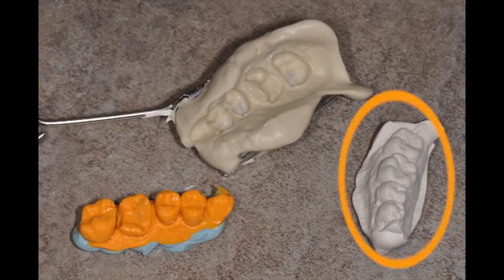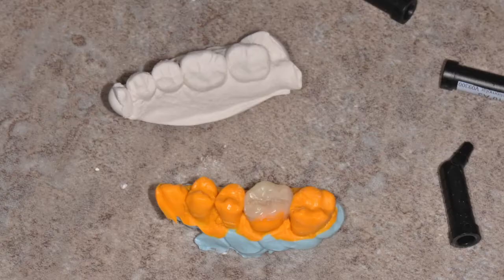The opposing side of the triple tray is poured with a quick-set stone and will be used to establish the occlusion for the composite onlay outside of the mouth. A microfill composite, which exhibits great wear properties and flexural strength, is incrementally placed on the silicone die and sculpted to the desired shape and anatomy. The opposing cast can be used to establish the occlusal stops on the composite surface. It is then cured with any light curing unit to initiate polymerization.